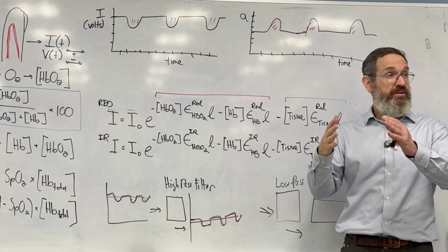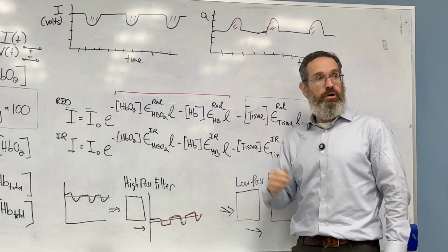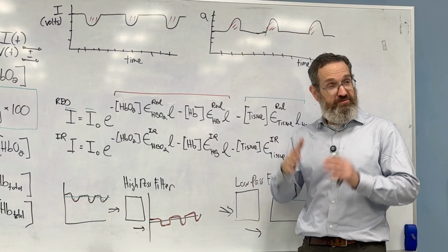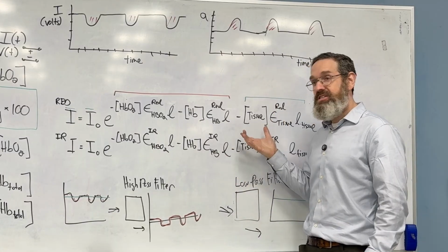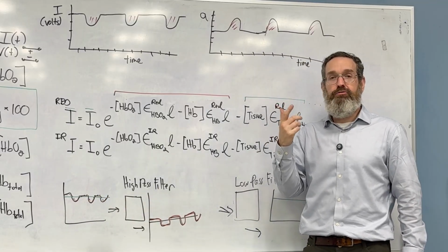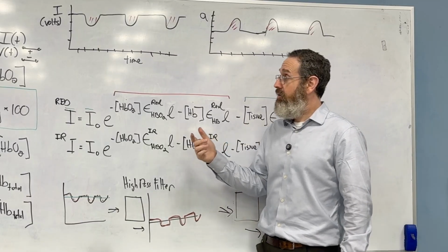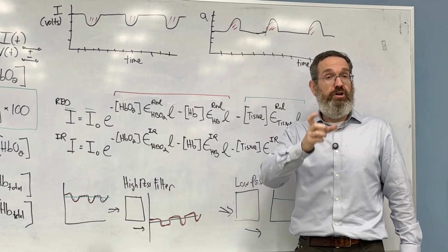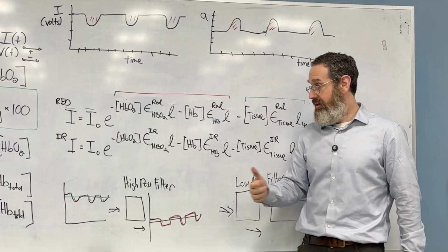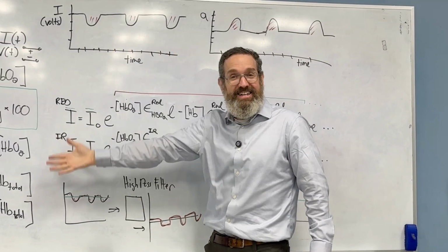Let's say Emily has very thick bones. This will work. Let's say Emily has very thin bones. This will work. Let's say Emily put on an extra layer of sunscreen this morning, because she's very conscientious about that. This will still work. So the power of the filters is they're incredibly powerful because you don't need to know that. And if Emily's heart rate goes up from 60 beats per minute to 80 beats per minute, this still works because it's still high and it gets through.